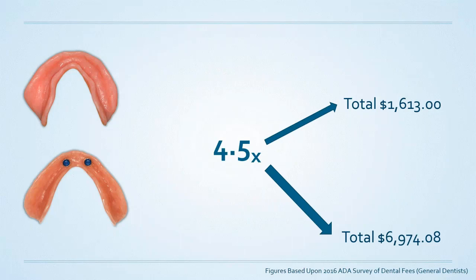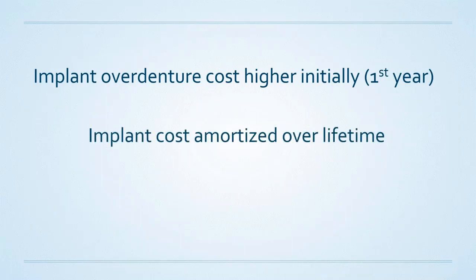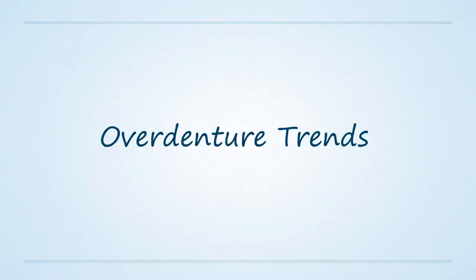Is it really worth it? Well, I kind of gave it away a little bit earlier in that earlier slide because the answer is yes. The research shows that the implant overdenture cost is initially higher the first year. However, it's amortized over a lifetime, and oral health quality of life improves by almost a third. And the research over and over and over again shows that trend.